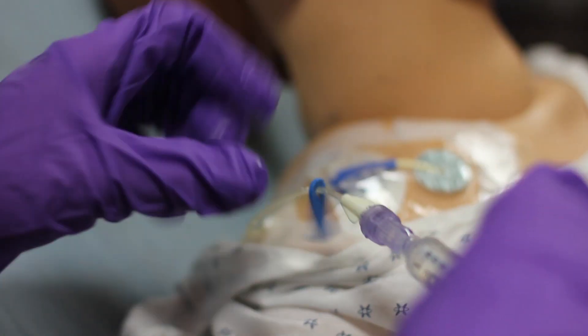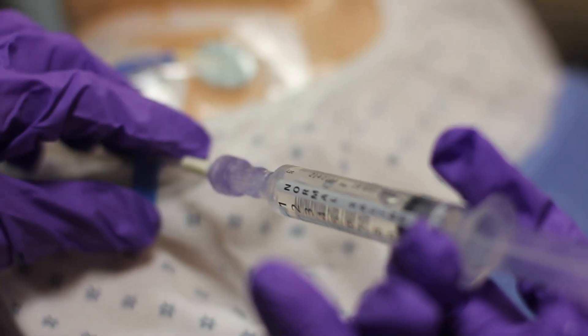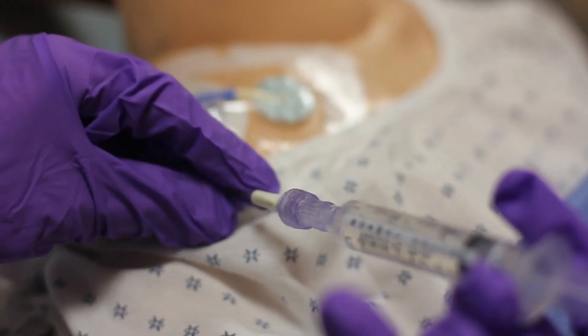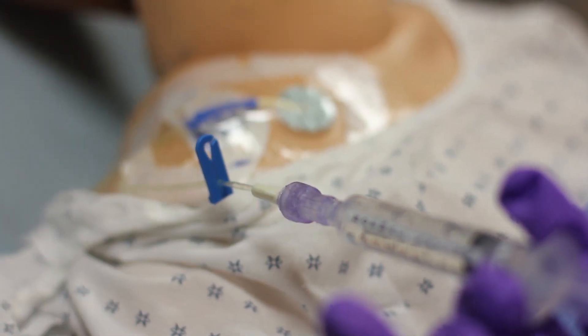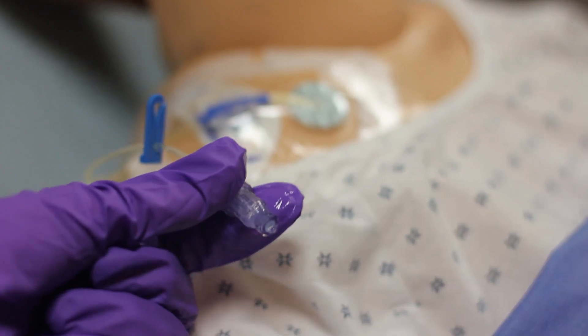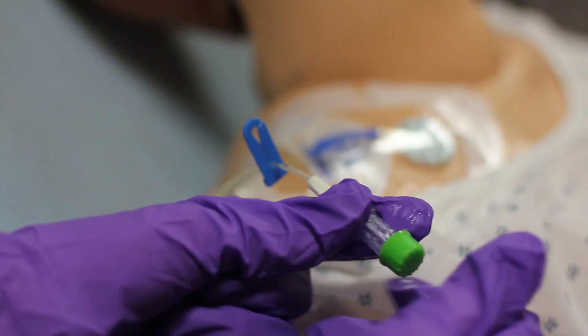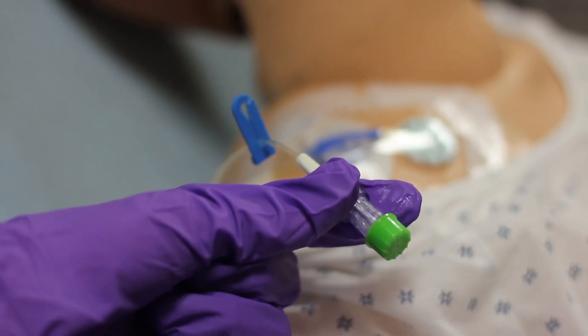Once the cap is affixed on the hub, draw back for blood return. If blood return is present, flush as indicated by protocol at the facility. Once this is completed, affix the green sterile cap. You'll repeat this procedure for each cap change.